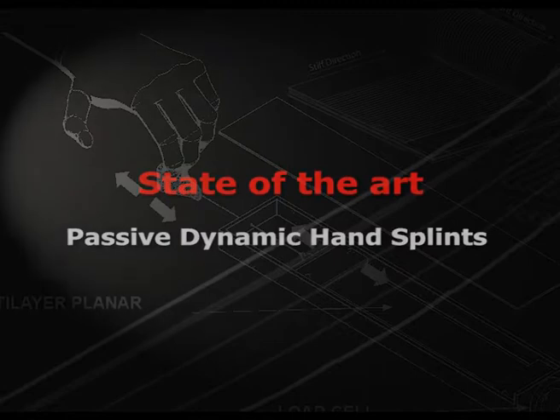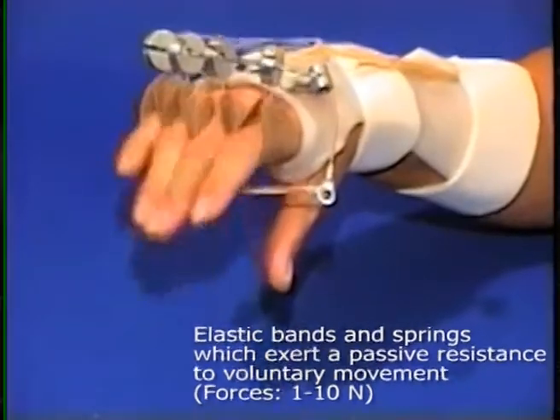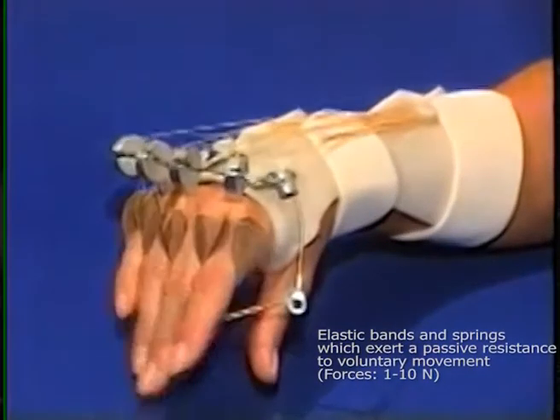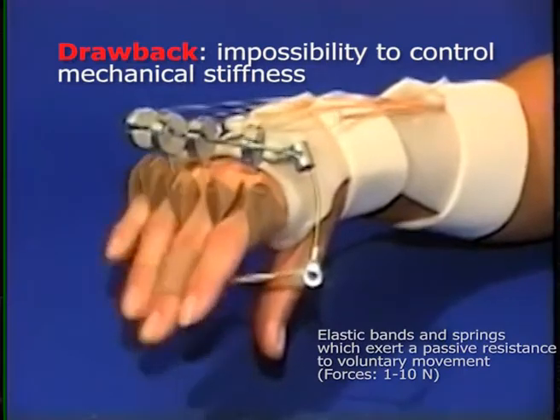Today, self-rehabilitation is performed by using elastic bands and springs which exert a passive resistance to voluntary movements. The drawback is the impossibility to control mechanical stiffness during exercise.